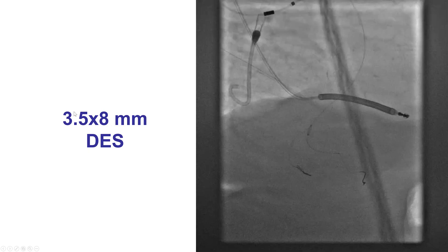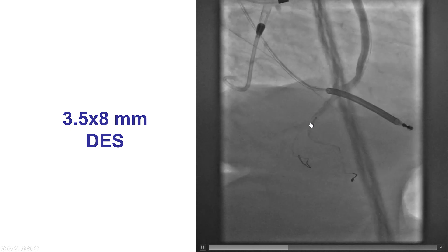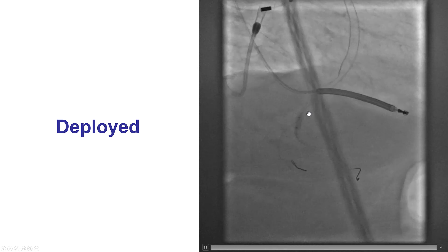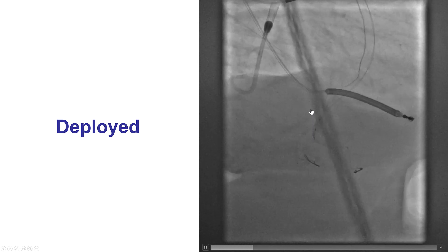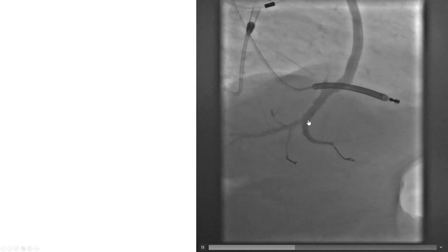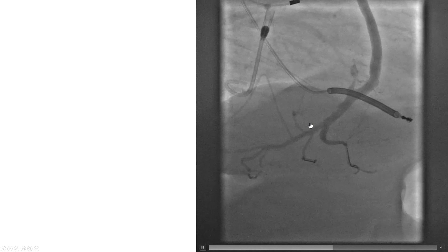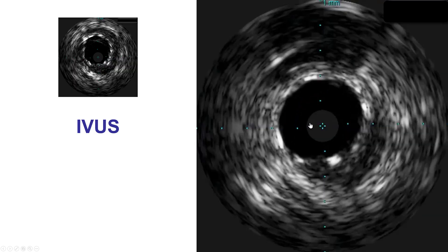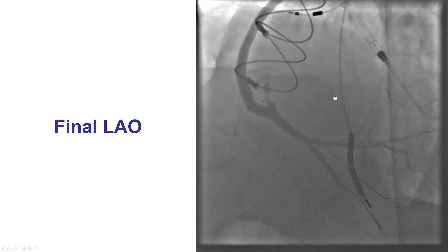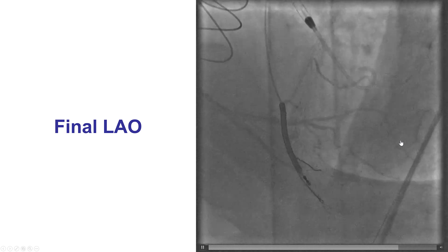So we placed a short 3.5 by 8 mm drug-eluting stent coming back slightly into the distal right coronary artery. It was deployed, and sometimes when we deploy the stents, we do a contrast injection to confirm we didn't go too far back. This provided a nice result with TIMI 3 flow into the right coronary. The flow in the posterolateral was not affected — we had the guide wire jailed there in case any problems arose. IVUS confirmed the stent was well expanded and covering the lesion entirely. The final picture showed a nice result in the PDA and good flow in the posterolateral vessel.